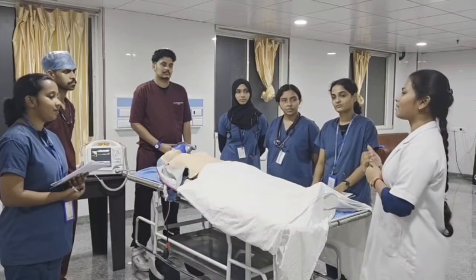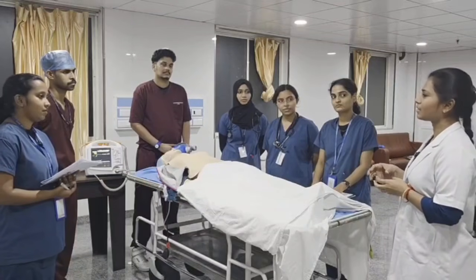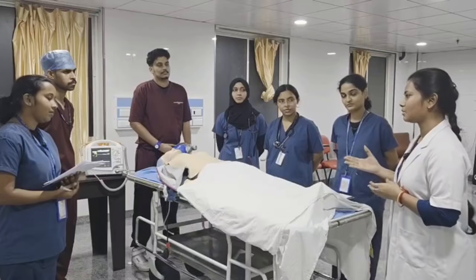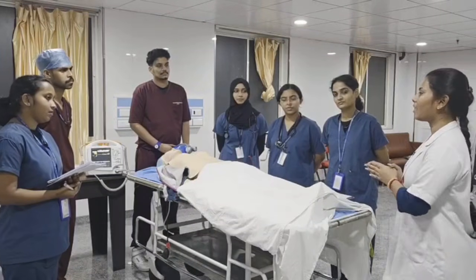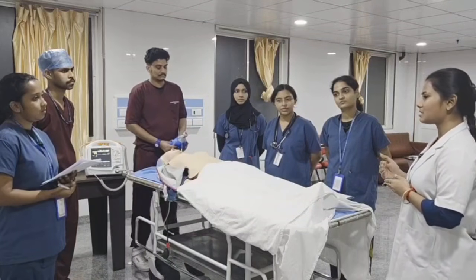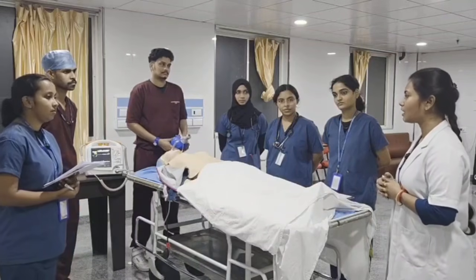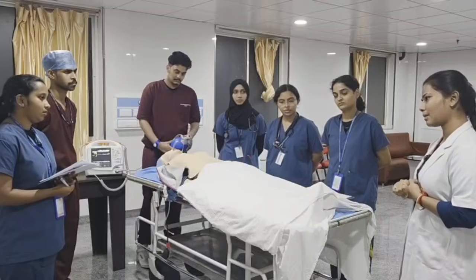Yes. So we have received a patient who underwent PCI 3 hours ago. Now she is reporting central chest pressure and pain. For that, first we assessed the responsiveness of the patient and saw the patient is not responding. Then we connected to a cardiac monitor and got the vitals: the saturation is not recordable and the patient is hypotensive. So first we attached oxygen supplementation and then we checked the rhythm. The rhythm is showing monomorphic VT with pulse.